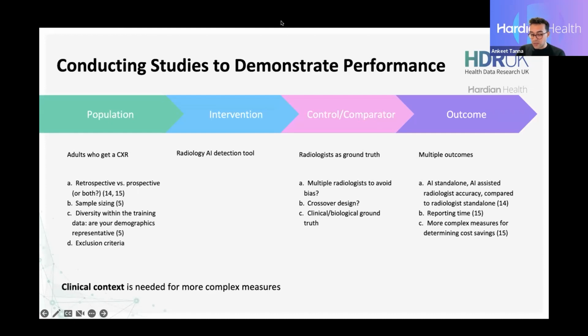So let's say you've defined it and you've done an evidence review, which tells you the best study design for your particular device, and what expected performance you're intending to have. You've developed your software and demonstrated a prototype version of the tool works through training and a small holdout internal test set. You've gone through analytical validity, showing that each feature works, so for example, we've been talking about, is there a feature for PMS, post-market surveillance, yes, no, and an open text box for any discrepancies?